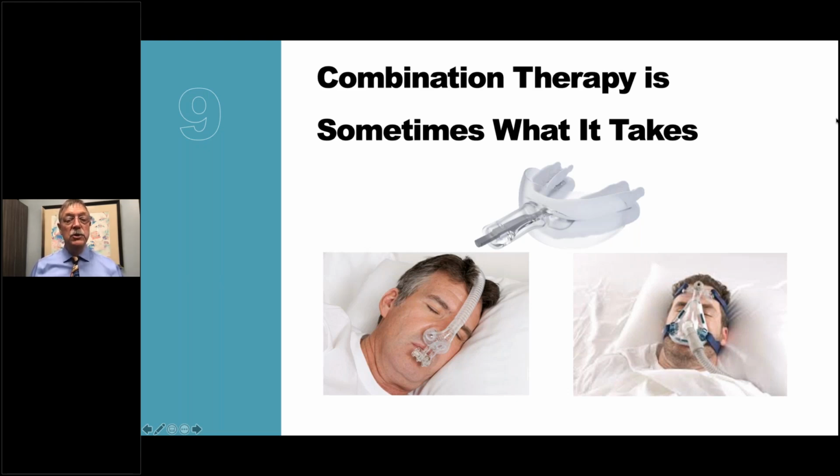The other thing you can do is use something like a MyTap and put that underneath a full face mask of their CPAP, and that can also oftentimes make a big difference. Unlike really any other type of interim device, that silicone shield keeps the pressure from a CPAP from poofing out through the mouth, another common complaint of CPAPs.